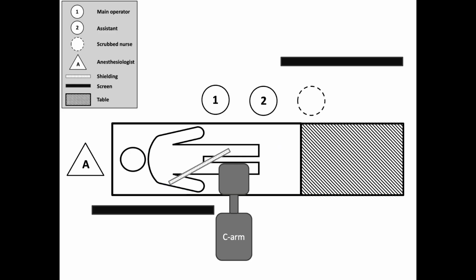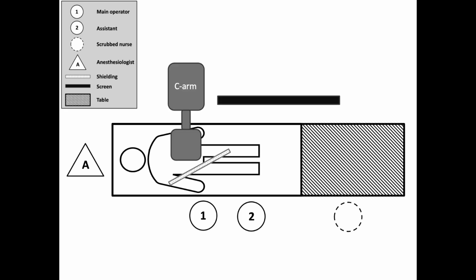Antegrade femoral access. Following the setup shown in Figure 3, operators will position on the patient's left side. A table at the patient's feet might be prepared for potential retrograde puncture. Retrograde femoral access. The setup depends on the limb being treated.